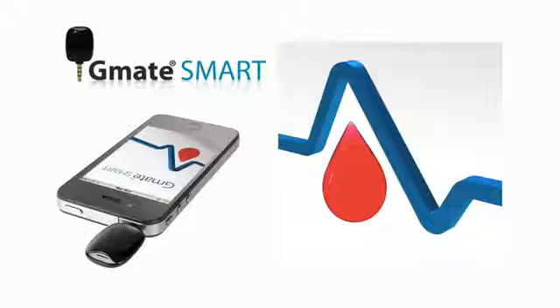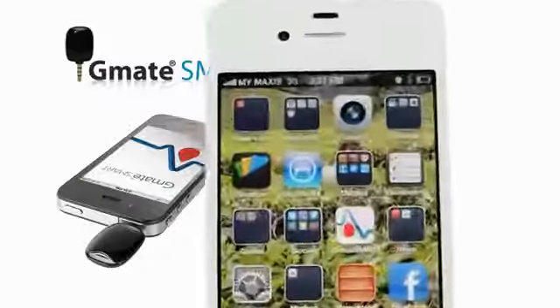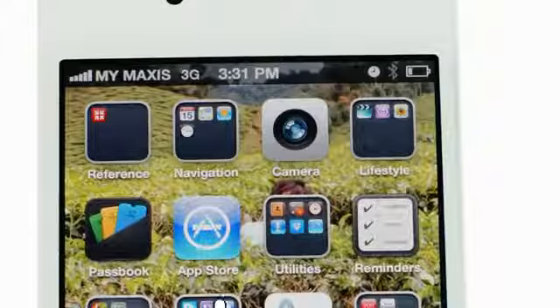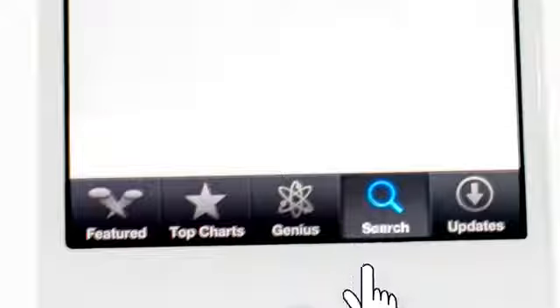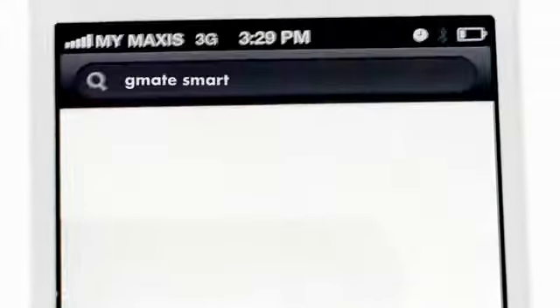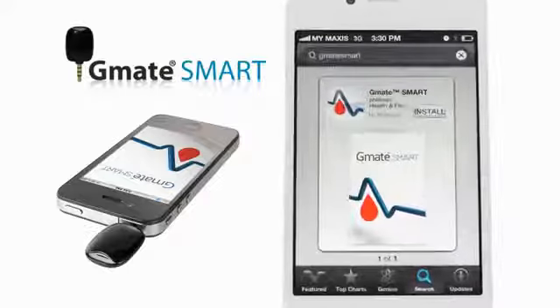The G-Mate Smart application is a free download from the App Store. To download directly on your smartphone, tap on the Application Store icon and select the Search tab at the bottom of the screen. Then type G-Mate Smart into the search bar at the top. Select G-Mate Smart from the list, then Install.